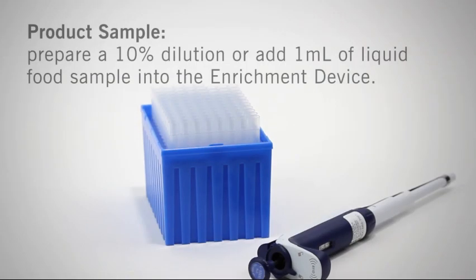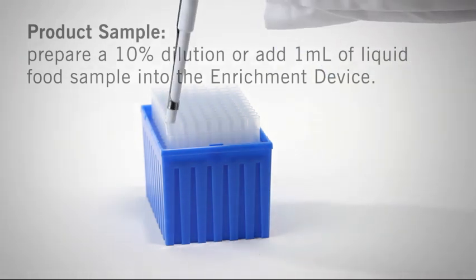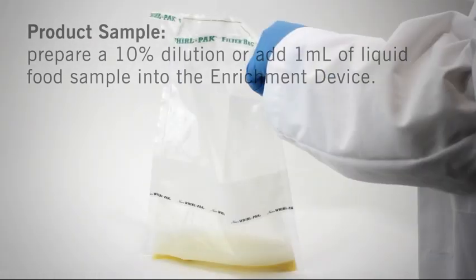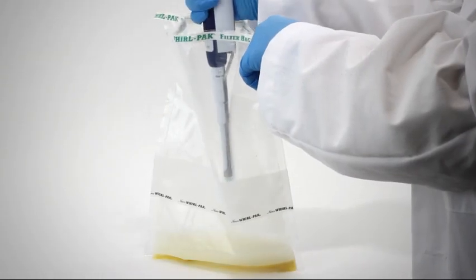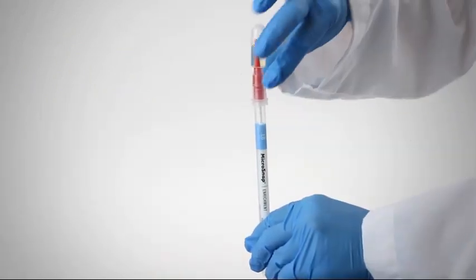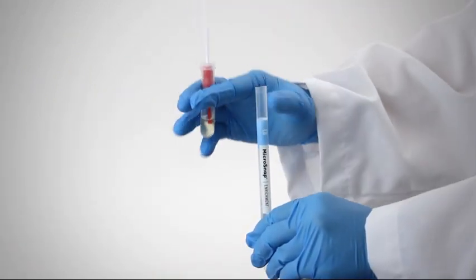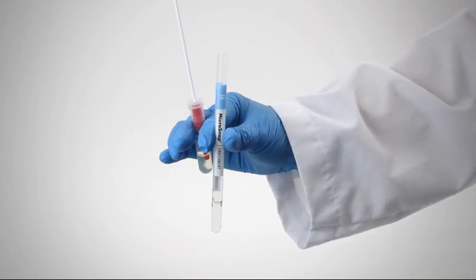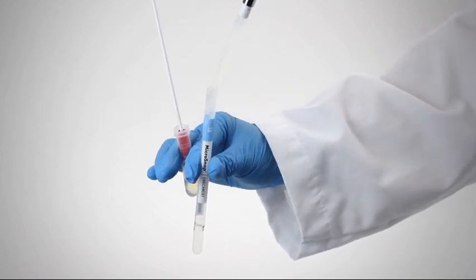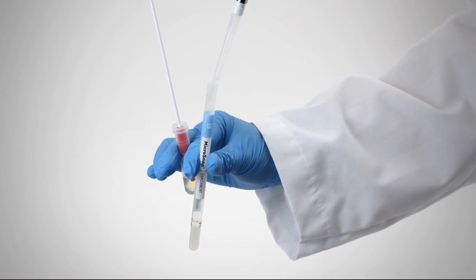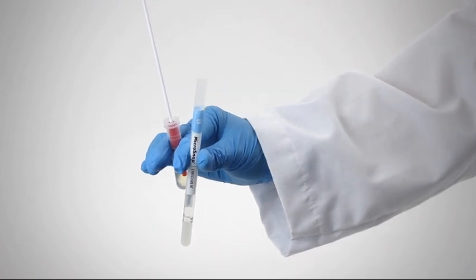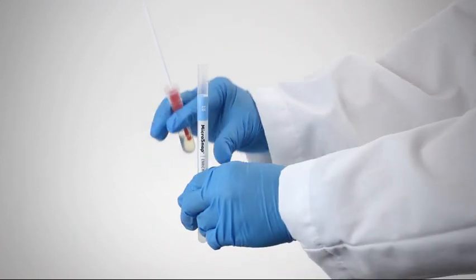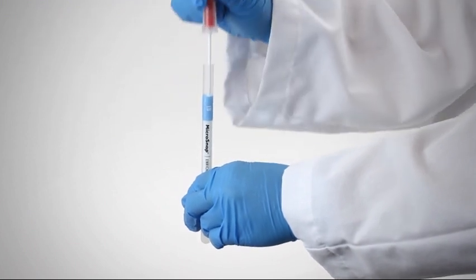For product samples, you may prepare a 10% dilution or add 1 milliliter of liquid food samples directly to the enrichment device. Replace the swab in the tube.